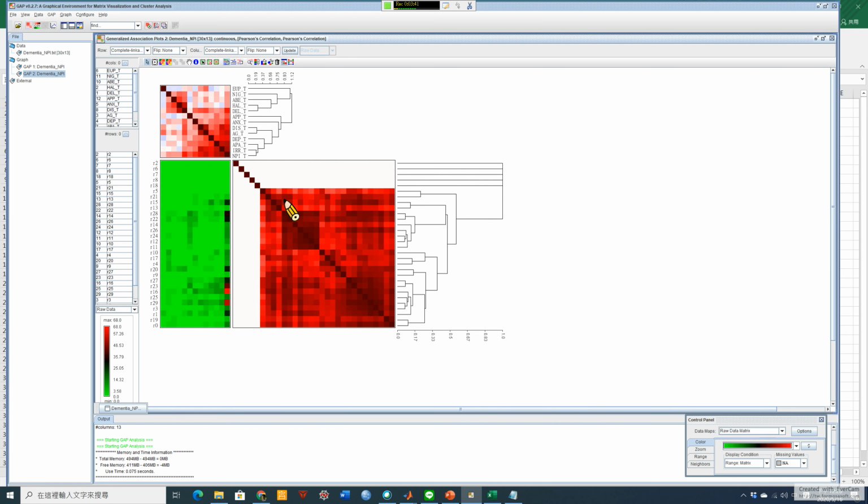Again, in these parts, the clustering of the cases may not be very intuitive at this scale of 30 patients, but I expect the clustering to be more meaningful when you have more cases. So that is the result of the clustering analysis.